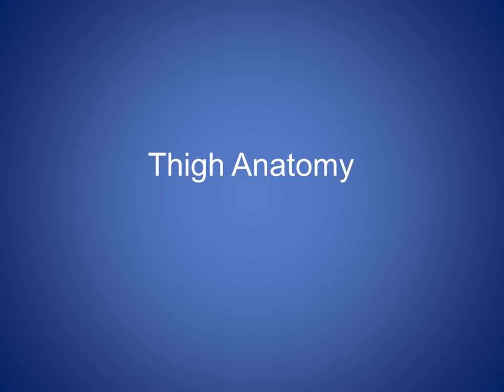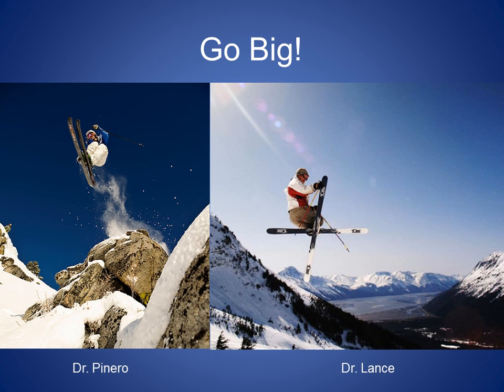So we go back into the room and we put the probe on there, and I'm looking at the patient. The patient's got 6 inches of insulation around their thigh, and you're like, oh my gosh, I don't know where I'm at. I'm totally lost in this big patient. And I think, big things are actually good. We're here in Texas, and Texans like big things, and where I live in Colorado, we like big things. In fact, I got a comp day coming up, and I'm going to go big at the resort.